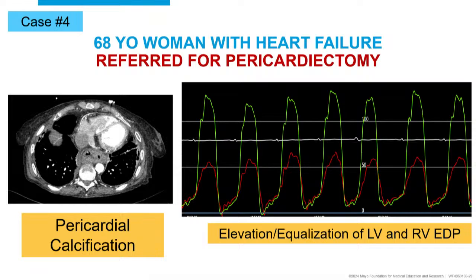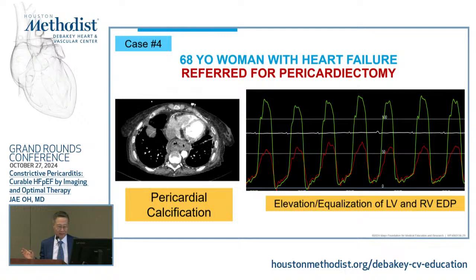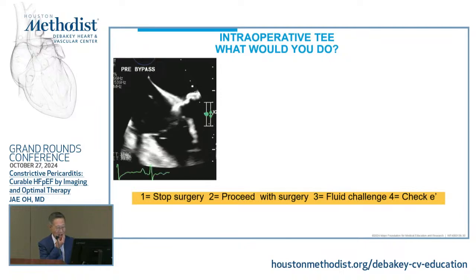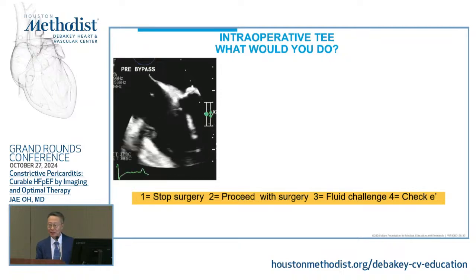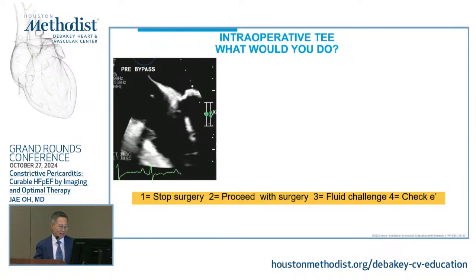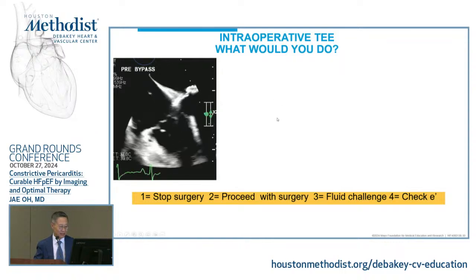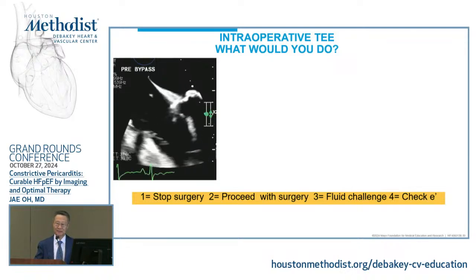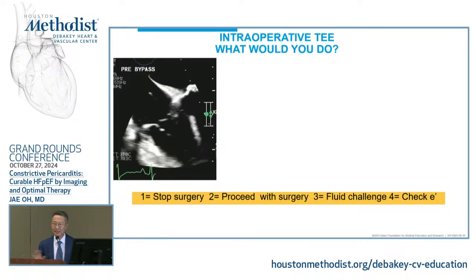So this lady is in the OR now, anesthetized, and the intra-op echo is being done by our anesthesia colleagues, doing intra-op TEE. What do you think he said to the surgeon? Looking at this, this is probably the only case I've seen that way. The anesthesiologist said, I think the patient does not have constriction.